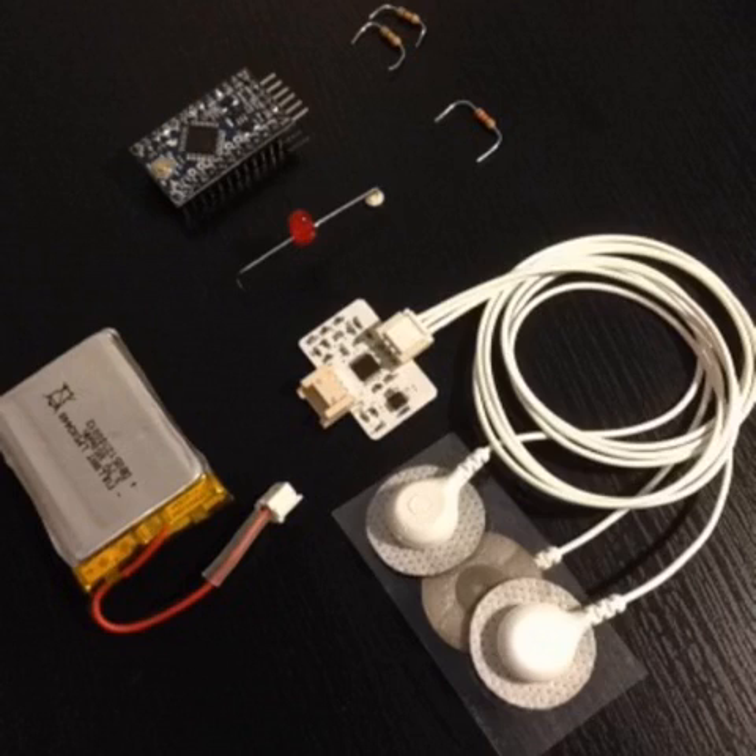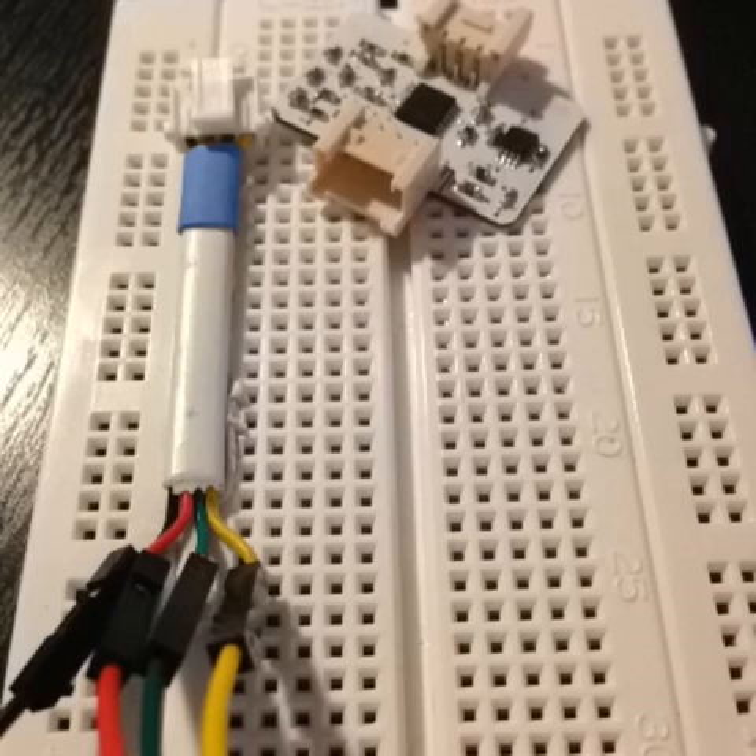Today we'll see how to make a heartbeat controlled LED using a Vitalino ECG sensor and an Arduino board. Here's the Vitalino ECG sensor — in this case we're using a plugged version together with a Molex to open wires cable.